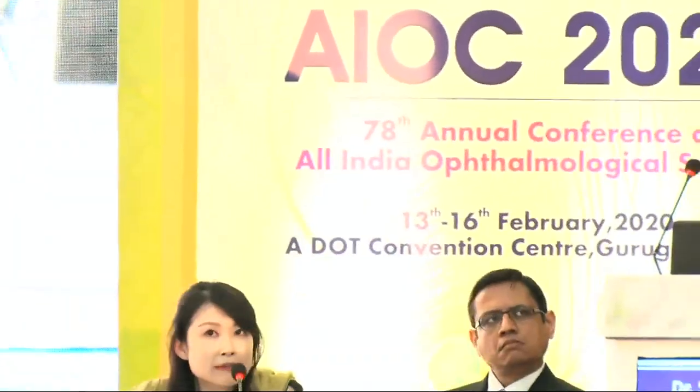Other question? Sanjay, I have one question for you. Thank you for the nice presentation. I'm wondering, sometimes with patients with severe edema, do you actually get good imaging with tomographic image measurement? Sometimes when there is severe edema, especially epithelial edema, the tomography maps are not going to be reliable, but you already have a clinical diagnosis in that situation. So such patients are not included in the analysis? Correct. These were all patients that clinically had no edema, but with tomography did have edema.